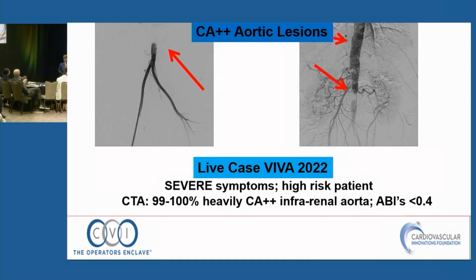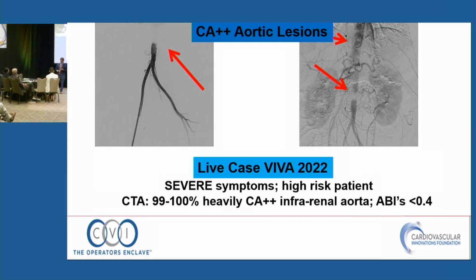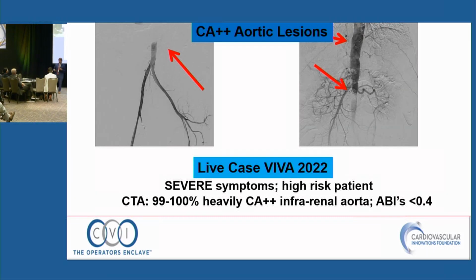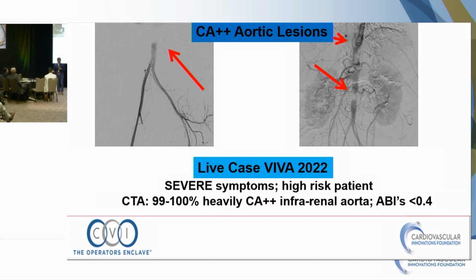So you got it. How old is she? 45 or something? No. She's old. And believe me, we had a couple of surgeons on the panel, folks that I know very well at Viva, and our own vascular surgeon looked at all of this, and she was not a good surgical candidate at all. Everybody's a good surgical candidate as long as... Even the brave ones, yeah. They all say it with a microphone in their hand. Sure, everybody's brave. I think I would put a covered stent on this and pray and assume I'm not going to rupture it. But in this era, this is an endo case. I would not do this open.